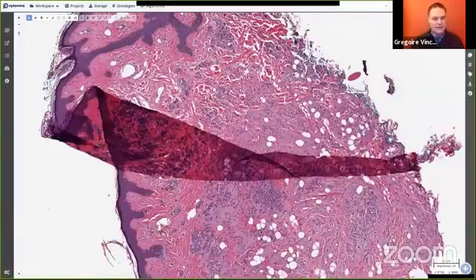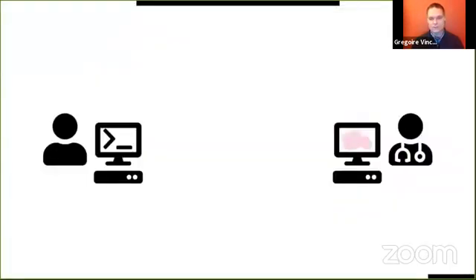And you must also avoid all defects in the sample preparation. Here, the slice of the sample has been sloped, and this can lead to an incorrectly trained AI. Also, as the samples are acquired with scanners, you can have blur, and the coloration robot can be out of date, so the coloration might not be consistent and always the same. So there are a lot of defects in the image that can lead the AI to be incorrectly trained. So there is a quality process that must be put in place.